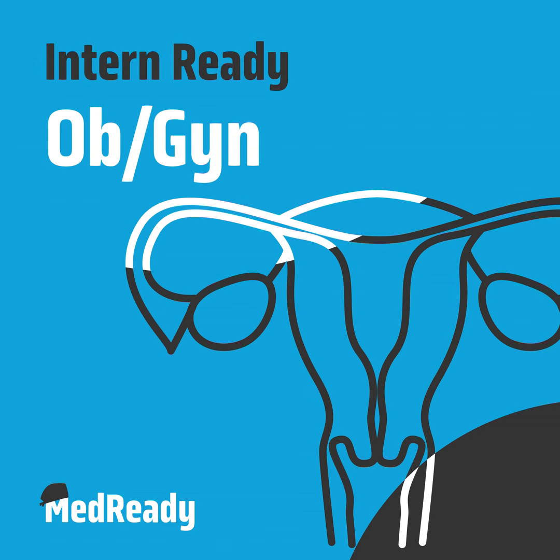The other things are things like a vasovagal reaction. Usually our anesthesia colleagues are managing this a little bit more, but that sometimes can happen with the fluid distension that's done in a hysteroscopy. Otherwise, when you're placing a tenaculum or using your lidocaine or any other instruments that are going around the cervix, you always want to be aware of any types of cervical lacerations. Excessive dilation especially can be a trigger for this.